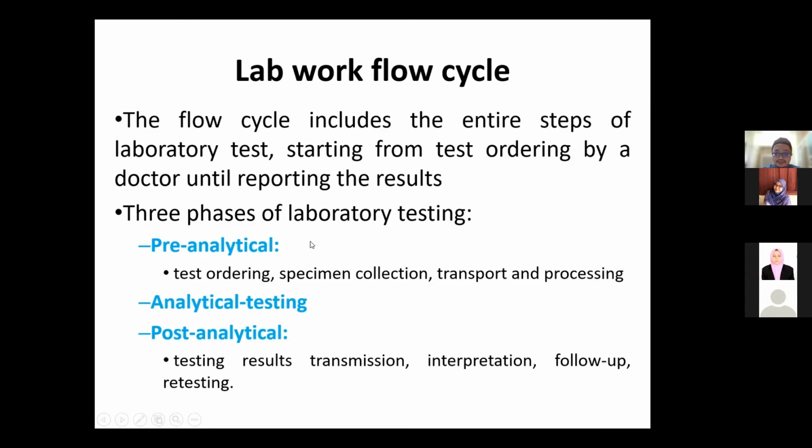Yeah, we divide the laboratory testing service into 3 phases. Firstly, the pre-analytical. Secondly, the analytical testing itself, and then the post-analytical phase. So the pre-analytical includes test ordering.